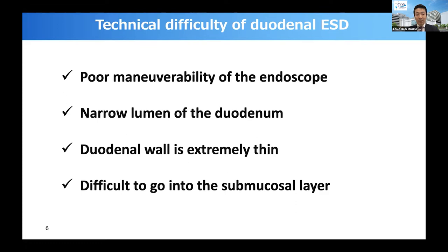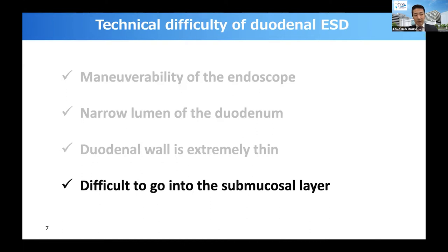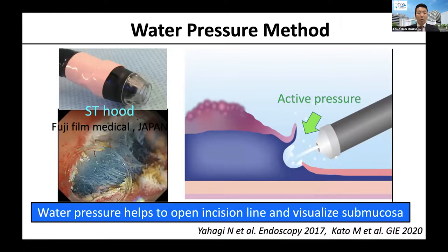Because of the narrow space in the submucosal layer, it is difficult to insert the endoscope into the submucosal layer. The key to the success or failure of ESD is slipping into the submucosal layer. To overcome this difficulty, Dr. Yahagi developed the water pressure method to facilitate the endoscope going into the submucosal layer using the water jet function and water immersion. The method also utilizes the tapered ESD hood.